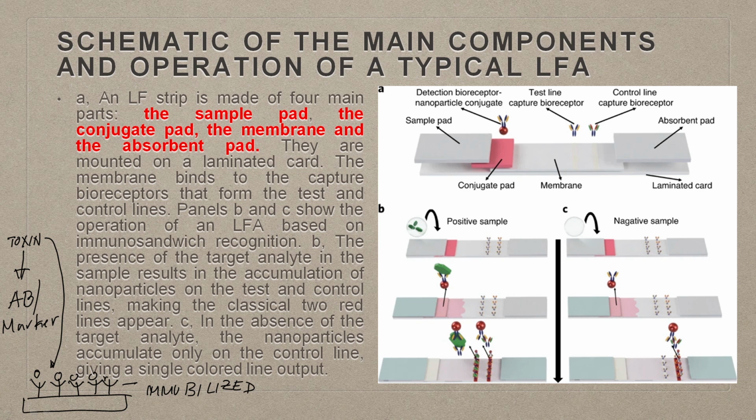Say, due to the binding there is a change in conformation, and you measure the conformational changes. Or there is some kind of fluorescent marker which gets activated upon binding of the toxin. Yet there are other ways where you try to see a competitive binding, which we talked about last time.